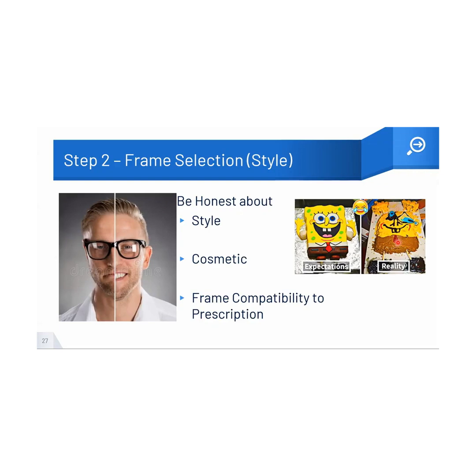And the rules that we spoke about for progressive also follow for single vision. As you are aware, even freeform single vision lenses will have a fitting cross, which needs to be bisecting, or it should be right against the pupil. You also have to make sure that the frame selections are done properly even for single vision cases.